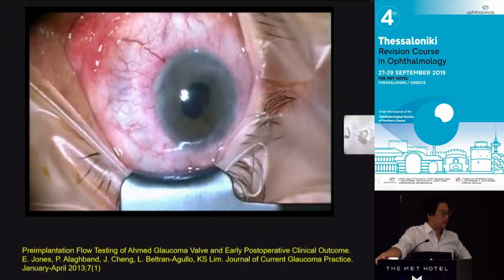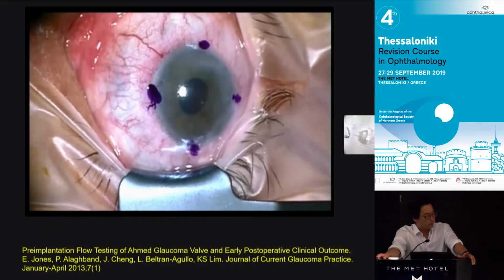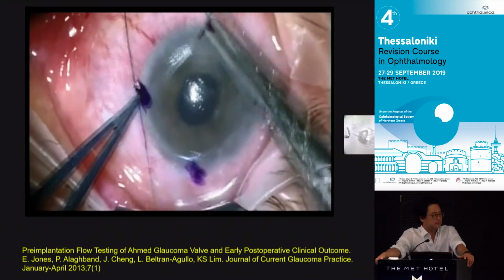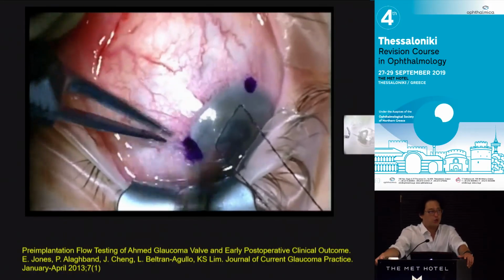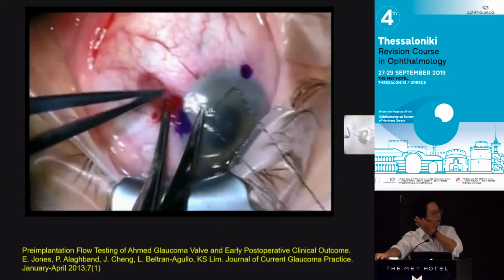And then do suture lysis at the slit lamp if the pressure goes up? So you have a restrictor all the time, so the pressure doesn't crash, and then you can control the pressure by lasering the sutures. You are absolutely right, it occasionally works. What I was trying to do is not to have to go back too often.